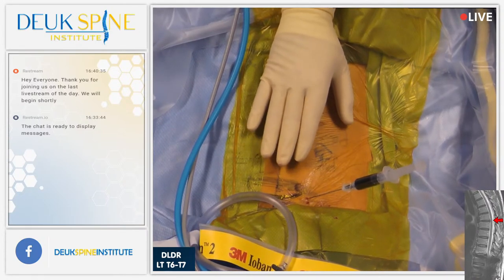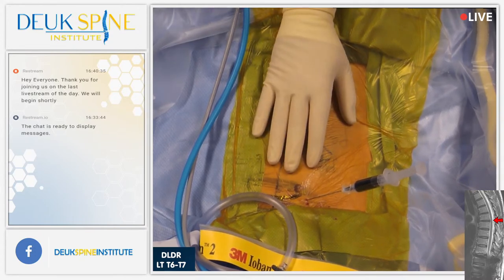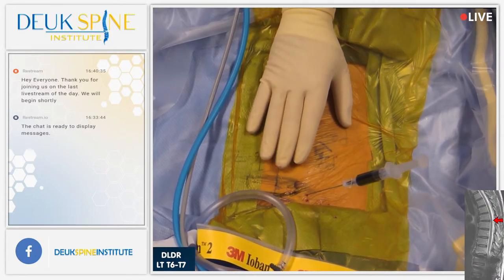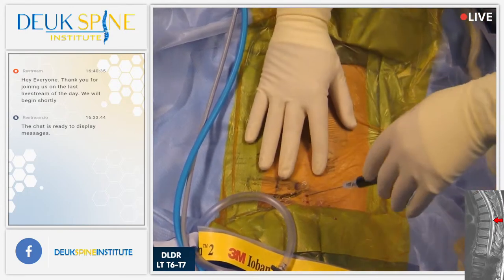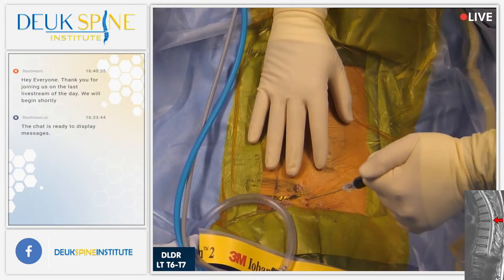All right, don't pick your body up. I'm actually looking to see if you're picking your body up. If you pick your body up, it means you're not there. Can you hear me? Yes. All right, are you having any pain? No? Okay, good. Well, let's see if that changes.